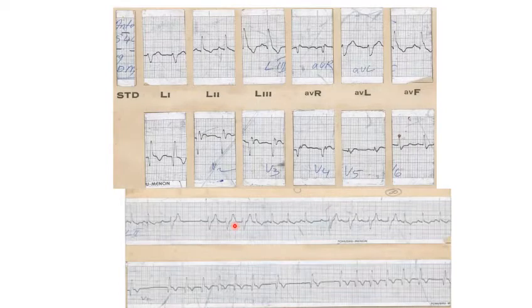So what is the problem of this patient? What can happen to this patient? This patient can go into complete heart block, sir. Yes. He has got a trifascicular block, and hence he has a risk of going into complete heart block. And actually this patient went into complete heart block, and we had to put in a permanent pacemaker in him.